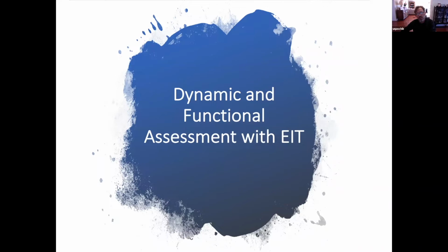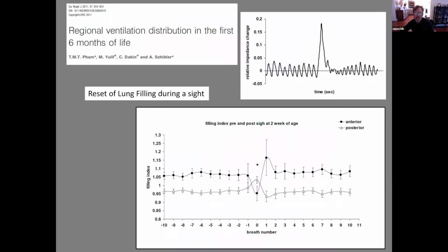A few interesting studies are recently coming up using EIT in mechanical ventilation. And there's some quite interesting so-called dynamic analysis and assessment of EIT in the ventilation space. I'll take you first through a healthy experiment. We've looked at healthy infants when they sleep, and they perform sighs at quite a frequent interval.